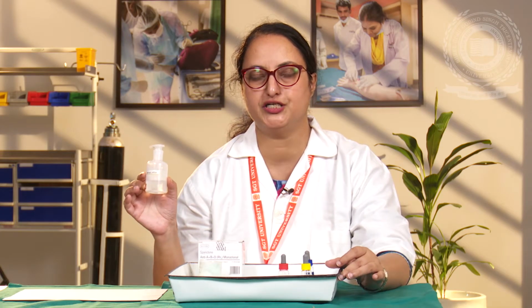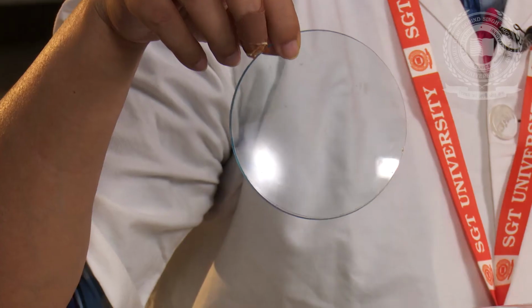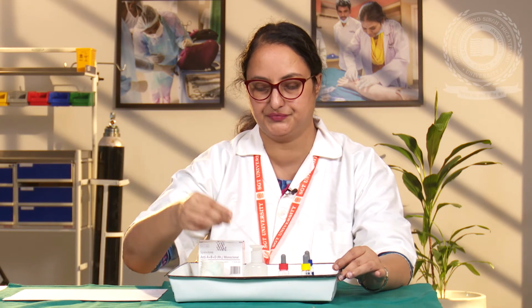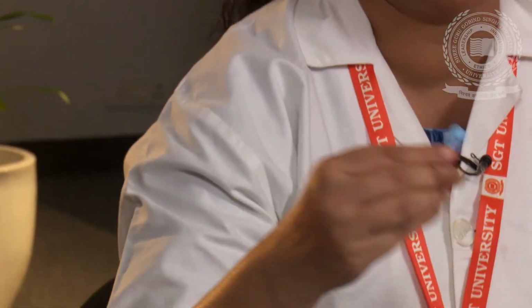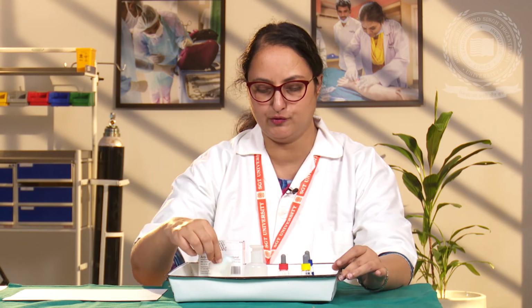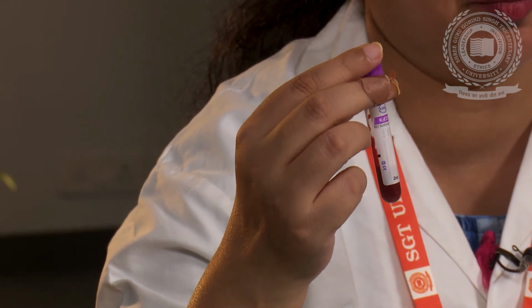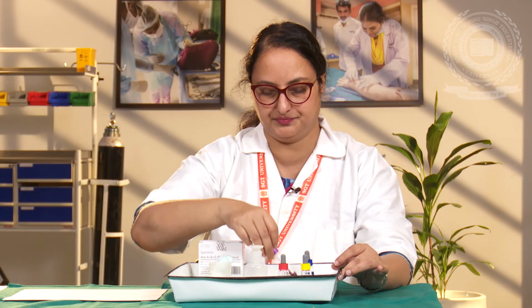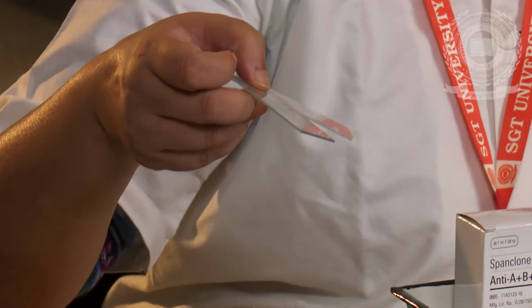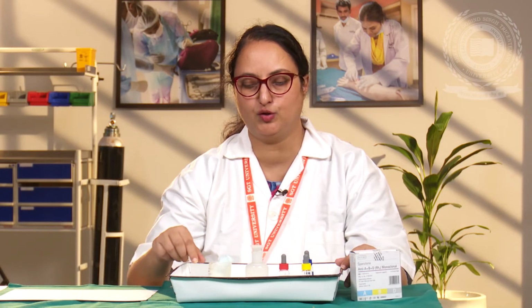Besides this, we also need a bottle of normal saline which is 0.9% NaCl, a watch glass, a dropper, a lancet and a spirit swab. I also have a vial containing anticoagulated blood which I am going to use for demonstration purpose. Also, we need 5 clean glass slides like these. Now let's proceed to perform the practical.